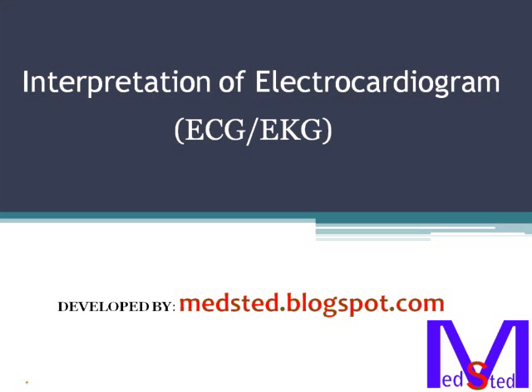This is an educational guide for the interpretation of electrocardiogram. First of all, let's clear a common confusion regarding the terms electrocardiogram and electrocardiograph. Electrocardiogram is the graphical interpretation of the electrical activities of the heart, whereas electrocardiograph is a machine which is used to take the reading of a subject.